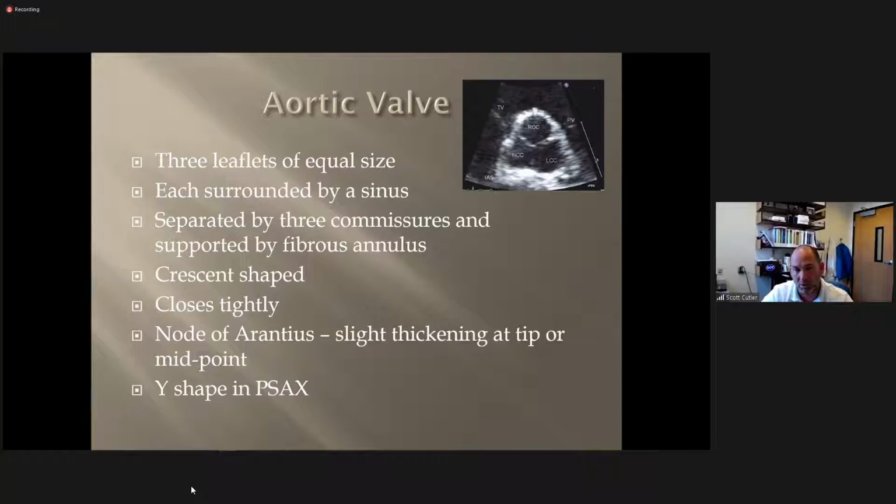So it's very important that we pay attention to these things, even the most subtle things. That's why you have to scan through the entire aortic valve. You're not only looking at the valve leaflets to see that they're thin and pliable, we need to see that there's 3, not 4, not 2, not 1. We need to see that they attach where they're supposed to, and that even if it looks like there's 3, it is opening like 3, or is one of those commissures closed? We're also looking at the wall to see that there's not a defect in the connection between the aorta and another chamber.